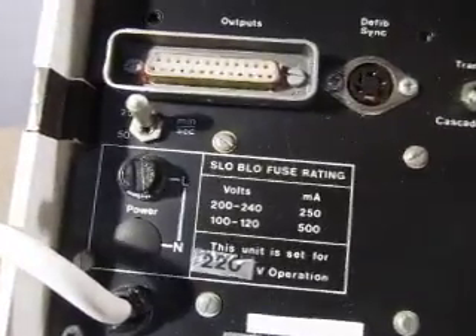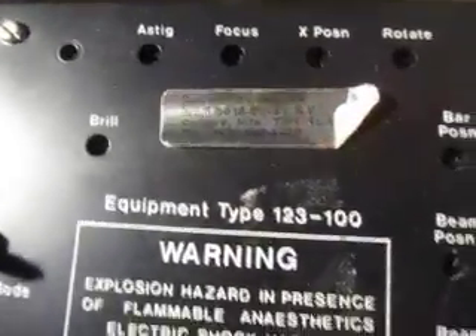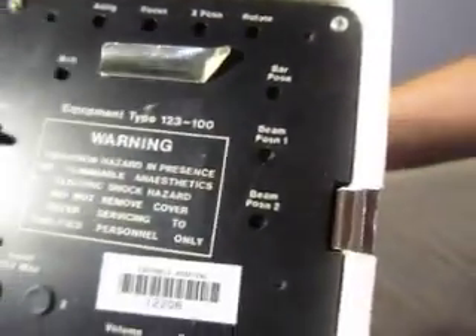You got fuse ratings here. Outputs. It's a defib sync. Here's a warning. And a bunch of other stuff, I don't know what it's for.